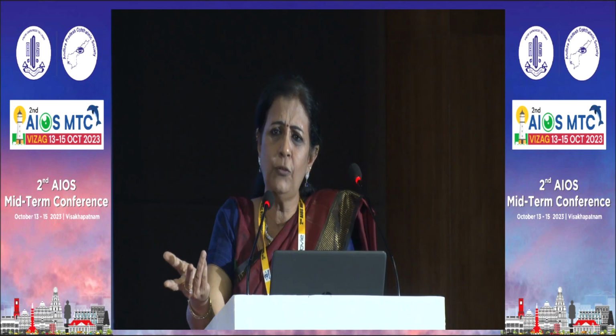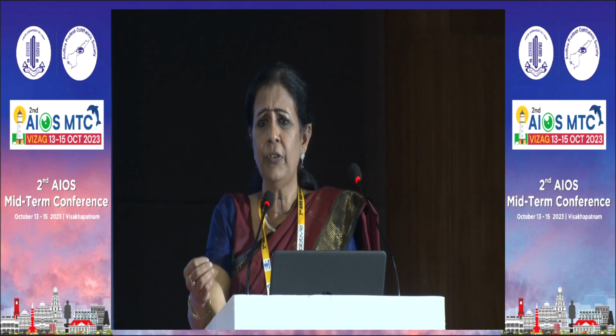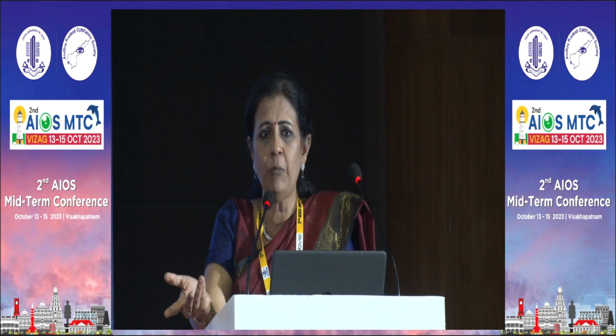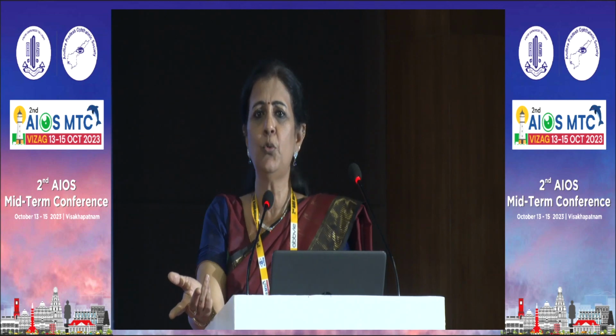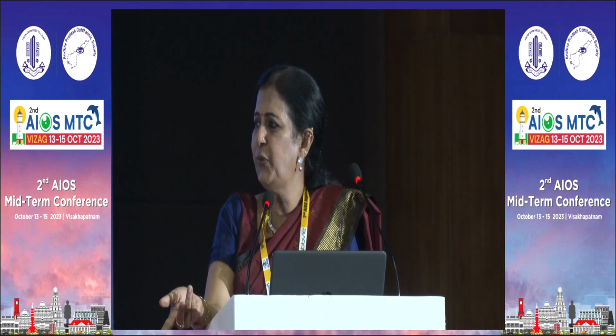Even if it is a monofocal, sometimes you might rarely have overcorrected, though I'm sure all of us are feeling so happy with our results, with the kind of biometry and formulae which we have, that every patient is seeing very well. But we keep that time interval. Maybe we are too conservative, but we have been doing well in our practice with that amount of conservatism.